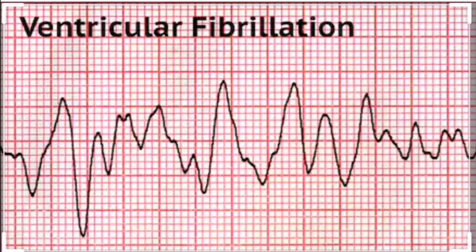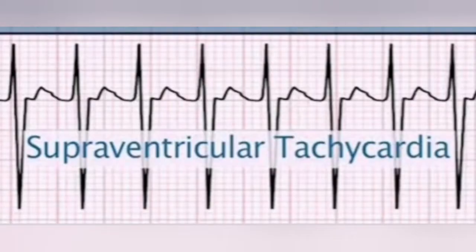As we can see here, first we show the normal ECG, and in the second I am showing some ECG from the monitor, started by normal rhythm, then premature ventricular contraction, which led to ventricular tachycardia, then it led to ventricular fibrillation, and after that it led to cardiac arrest.